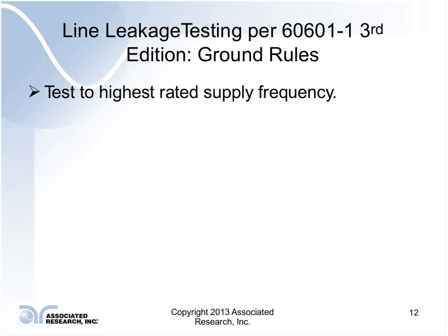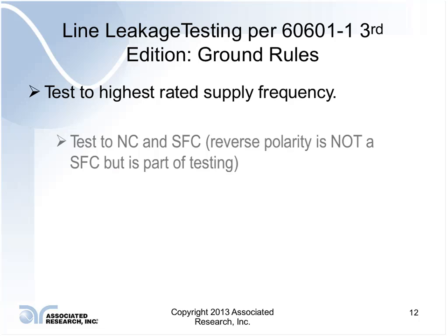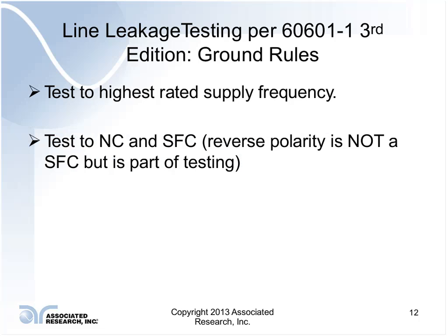Okay, so leakage testing per 60601 3rd edition ground rules. And what I mean by ground rules is these apply to all of the leakage tests no matter what type you're dealing with, whether it be earth, patient, enclosure. You test to the highest rated supply frequency. So for example, if your device operates at 50 and 60 hertz, you're going to run the leakage test at 60 hertz. Again, like I said, it's worst case scenario testing.